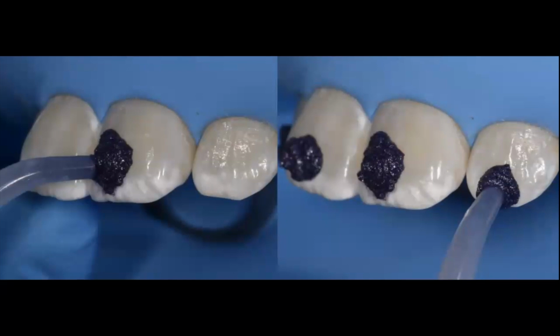And the product that we use is made by Ultradent. There are, I think, a couple of companies that still make this product to use in clinic. This one specifically is made by Ultradent. It's called Opal Luster. And what I like about it is that the color of it is purple, so it's very noticeable. It's very easy to see.